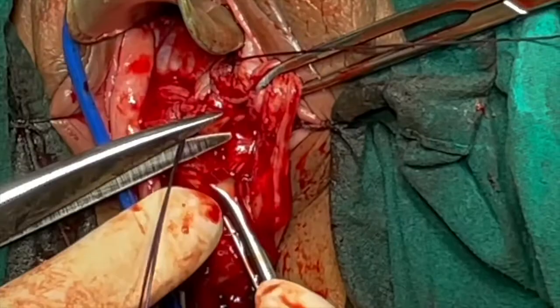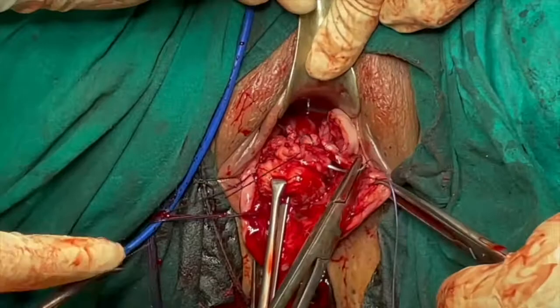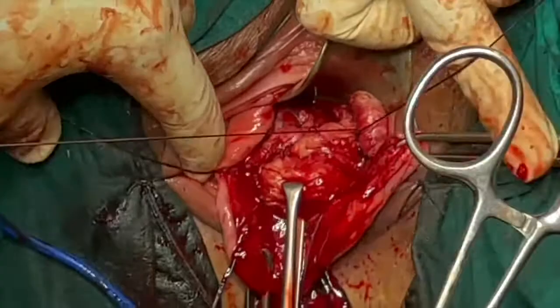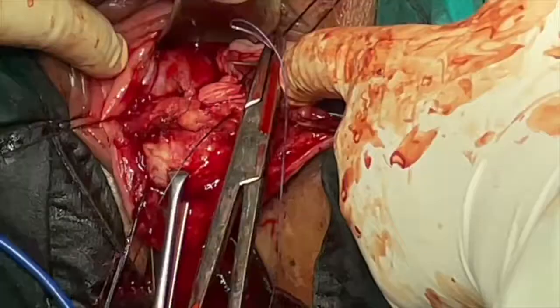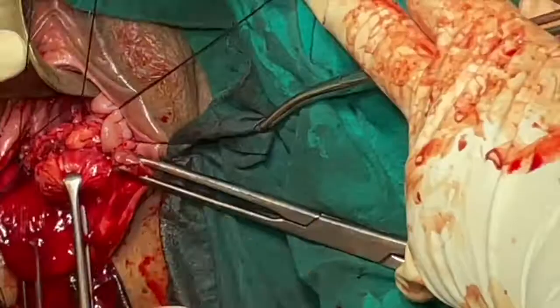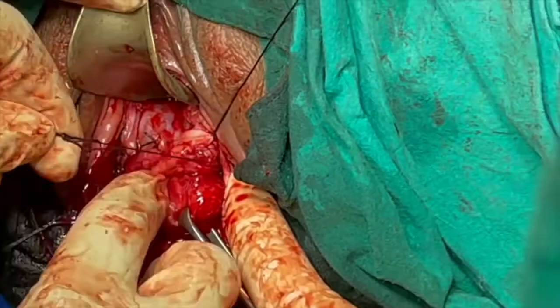You can see the Fothergill stitch is again repeated in the same way at different levels. The right stitch passes through the cut transverse ligament, then through the anterior cervix, and through the right side ligament complex. You can see the needle is passing through the anterior cervix above the previous puncture, which means you are bringing a good amount of the Mackenrodt uterosacral ligament anterior to the cervix. The advantage is that the cervix falls backwards in the pelvis, the fundus falls forward, causing good anteverson of the uterus, giving positional support to the uterus.